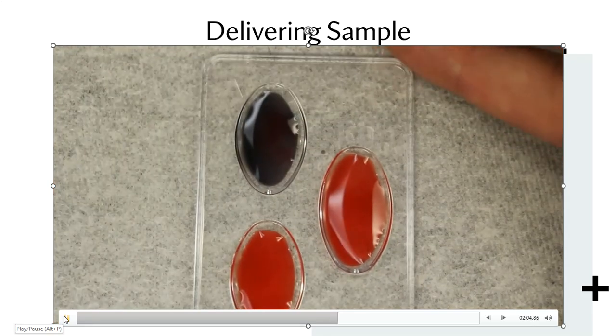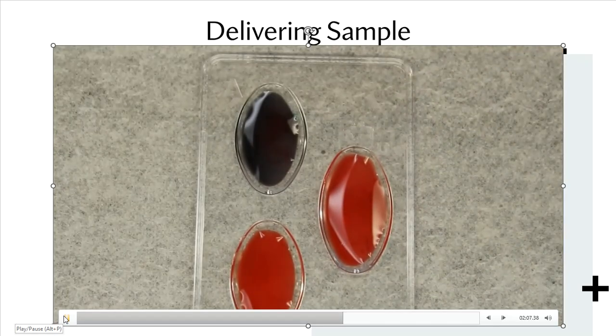All right. Now what's got to happen is that I've got to let these sit at least a couple of minutes. I'm going to say 2 to 3 minutes at least. What's happening is that the anti-serums are now reacting with your blood cells. You'll know if you're positive for A or for B, or maybe for both A and B, or maybe you're not positive for either. You'll also know if you're positive or negative for the RH. So A positive, A negative, B positive, B negative, and so forth, if these wells begin to clump.